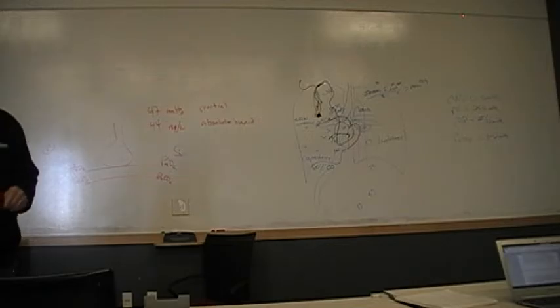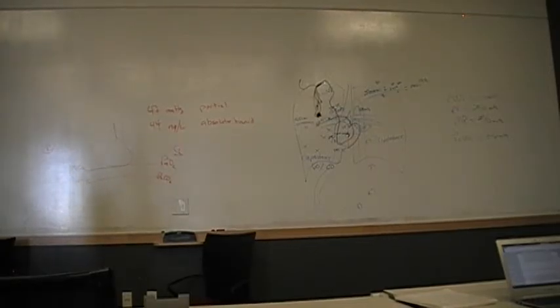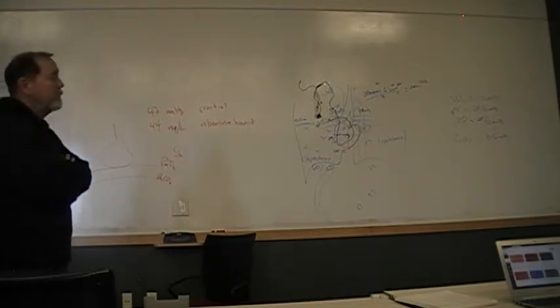It's represented by the diagram on the bottom of page 484. Usually at the bedside when these are being inserted, and I think I included a couple of videos on Canvas, it shows the waveform when it's inserted in the right atrium, the right ventricle, the pulmonary artery, and the wedge. So this last little bit is what the pressure is when it's wedged into the vessel.